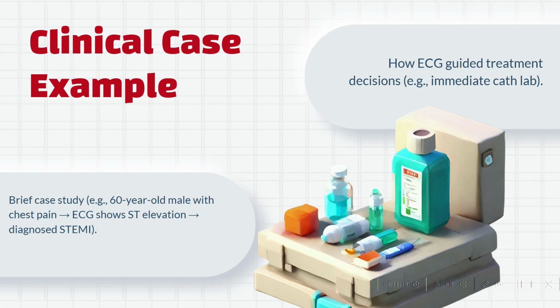Post-procedure ECG showed resolving ST elevations, indicating the reperfusion's success, and the patient was admitted for monitoring and further cardiac care.